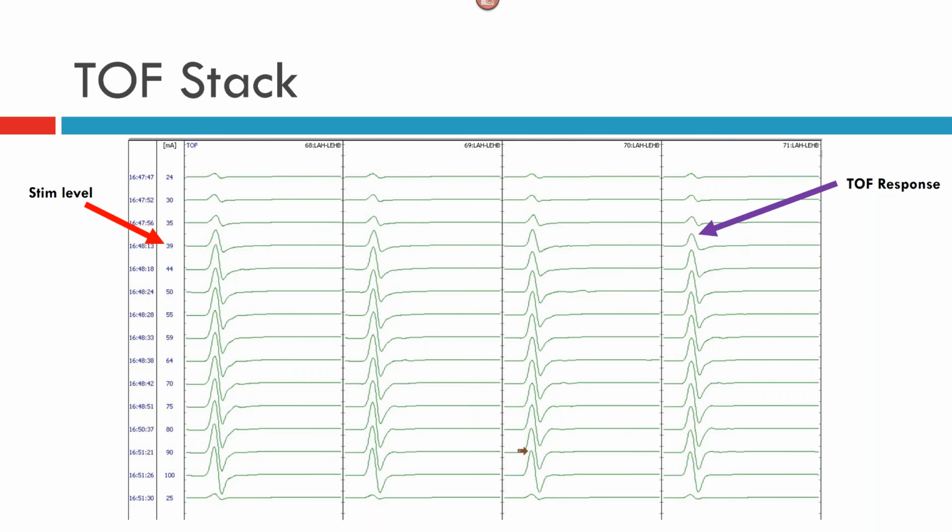So now the interpretation is very, very crucial for these cases, because if you are using 25, 35, 45, 55, it changes everything. If we stimulate the muscles and get a response at a threshold, and if you're supposed to get less than 5 milliampere and you stimulate at 15 or 20, then that means there is muscle paralyzed. And if you have to stimulate at 50 or 60 to get the same response you can get at 5 milliampere or 6 milliampere, that means the muscle is paralyzed.